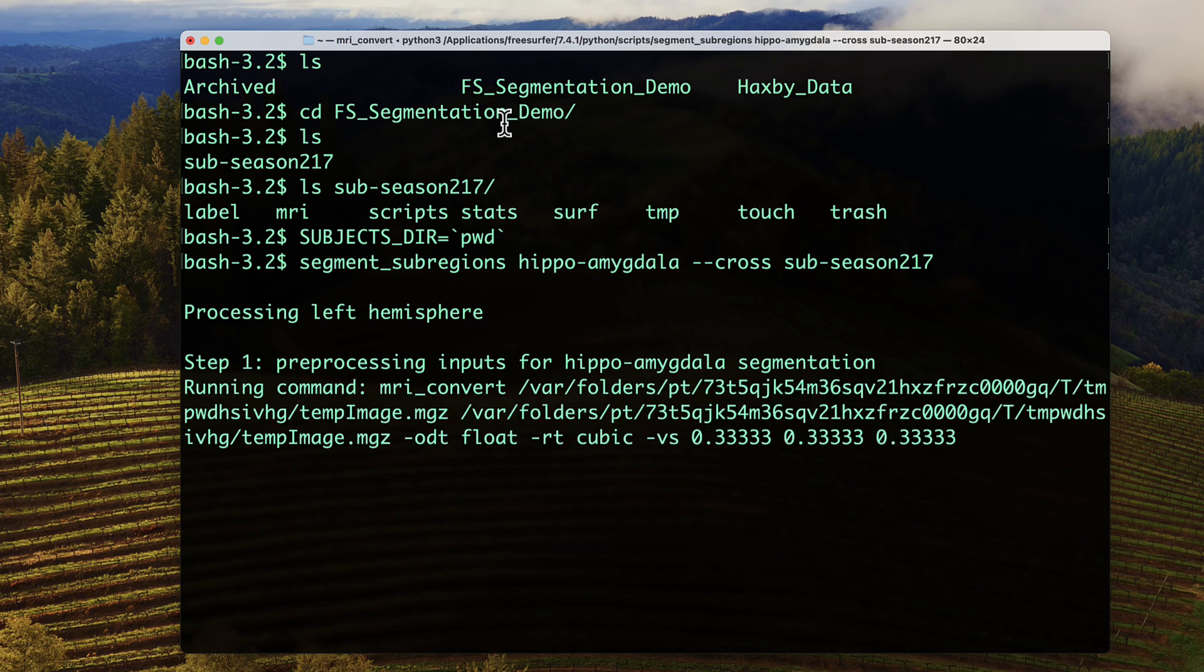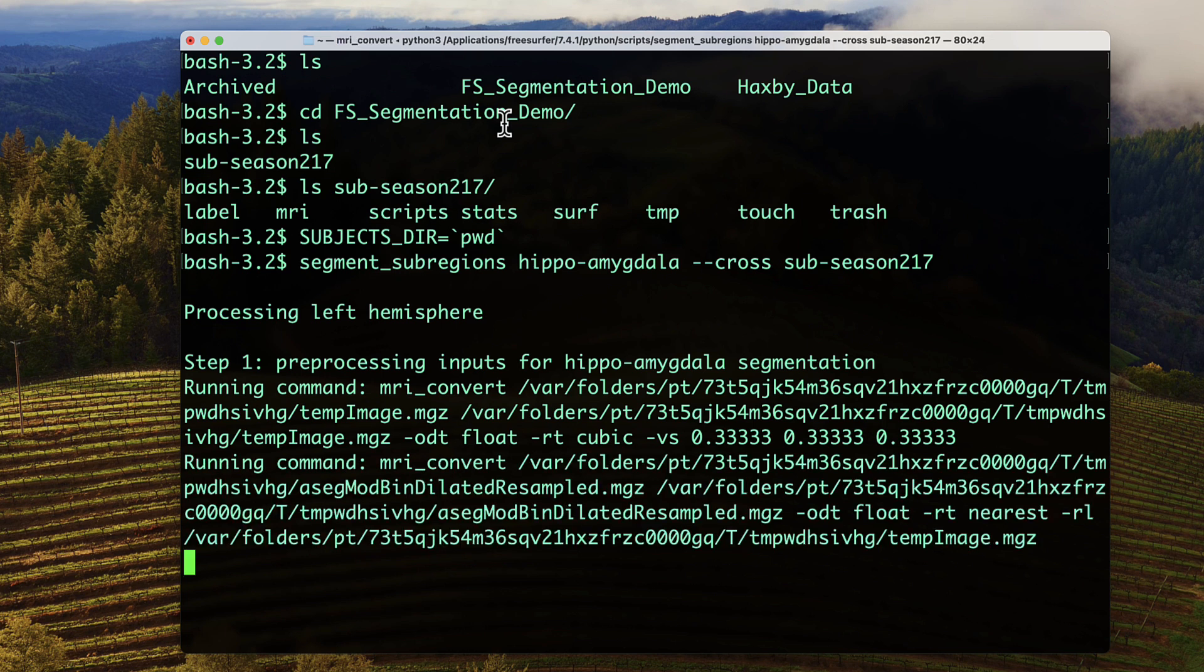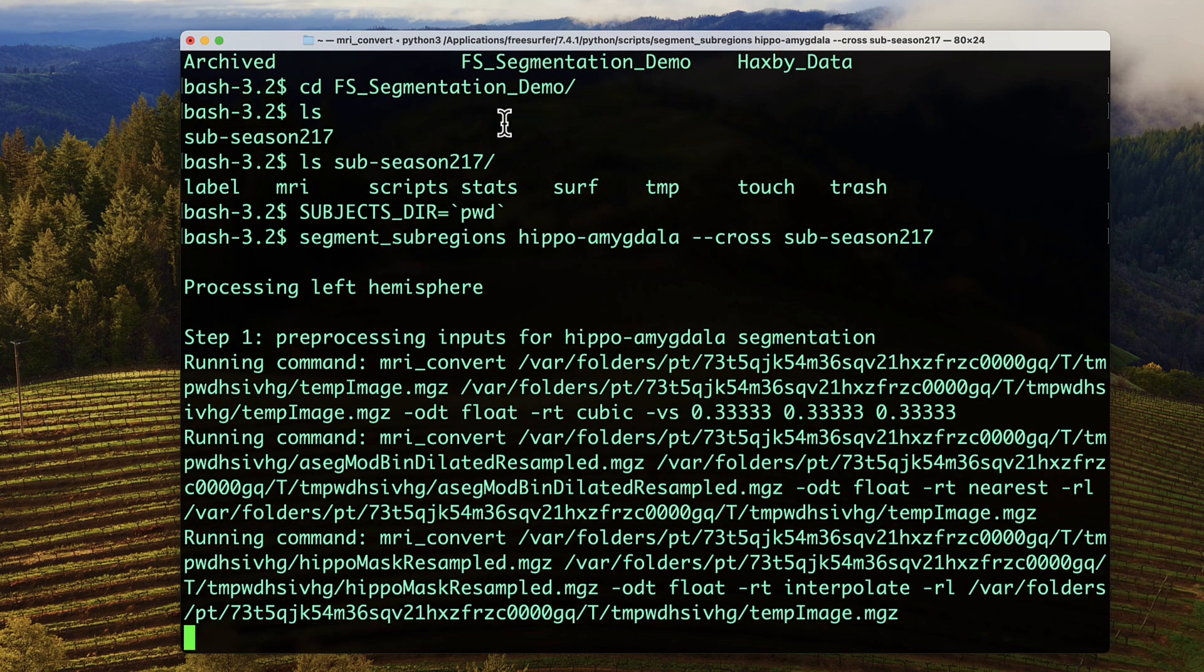If you look at the help file for segment_subregions, you will see how to do the same process for segmenting the thalamus and the brainstem. We're going to come back once this command finishes.